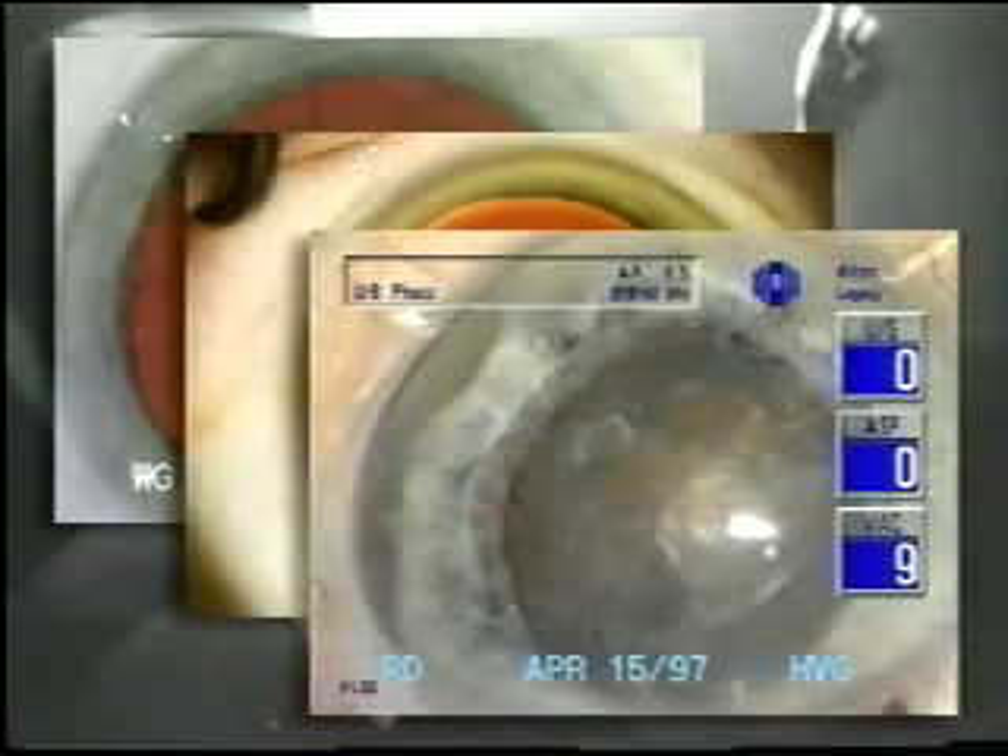Let's look at three situations: zonular dehiscence, a subluxated lens, and a traumatic cataract.